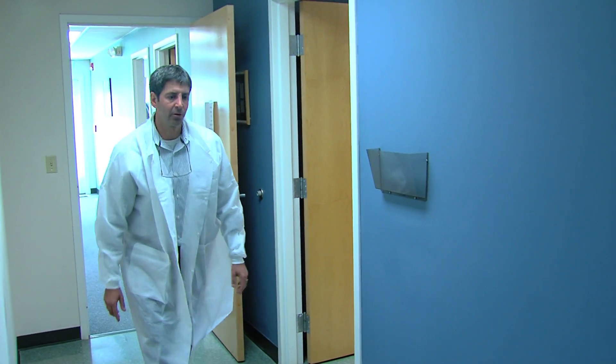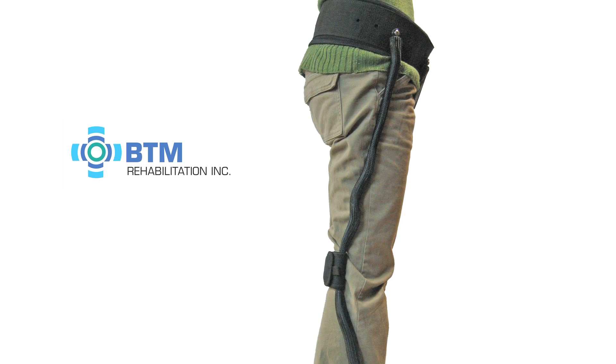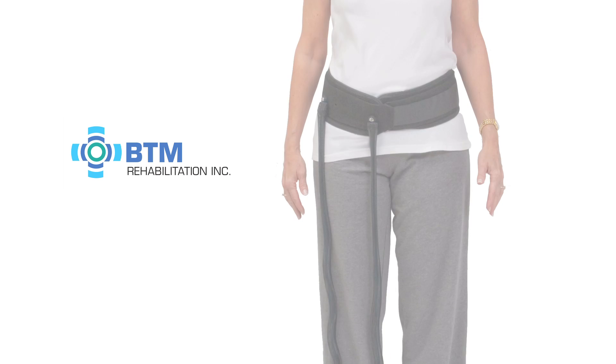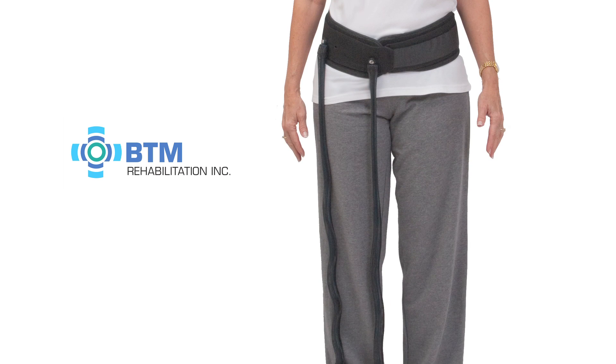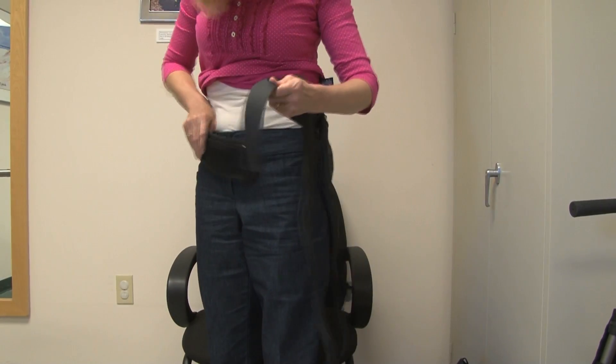So after about 20 iterations, we came up with the current design which is working well now. It simply goes around a patient's waist, connects to their foot, and it — no pun intended — puts some spring in your step.